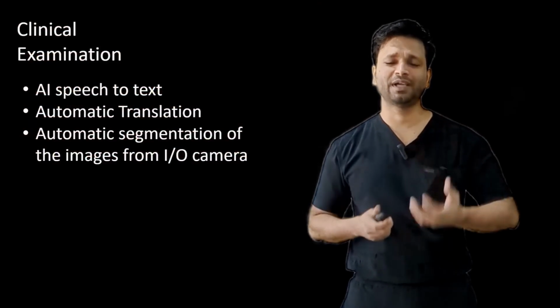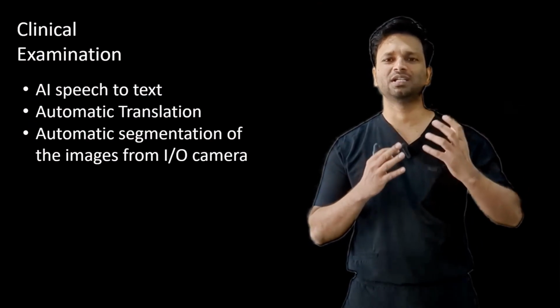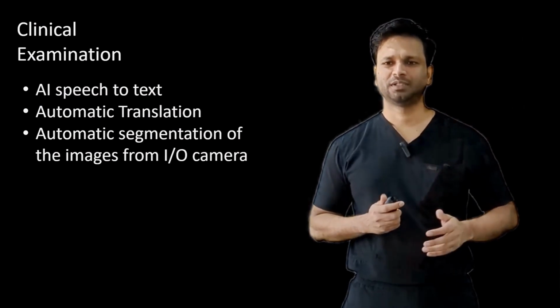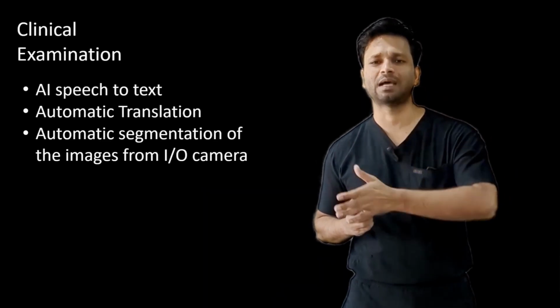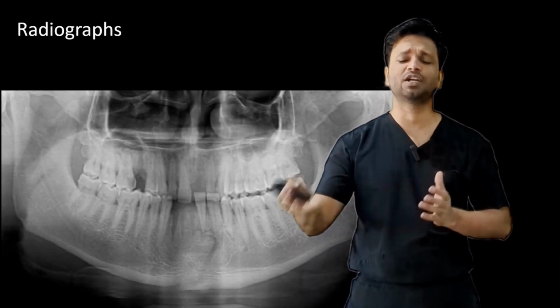And now imagine if we train on thousands of images of these multiple points, and we'll have an AI that is quite good at identifying intraoral lesions, be it oral cancer, be it caries, be it potentially malignant disorders, lichen planus, leukoplakia, erythroplakia, multiple things. Okay. So this is the application of artificial intelligence at the level of clinical examination. Now we move on, we see a caries, or for whatever reason, we advise a radiograph to the patient.